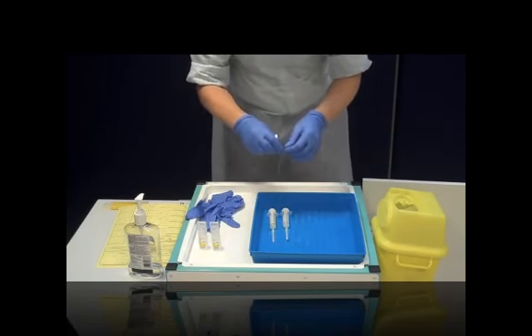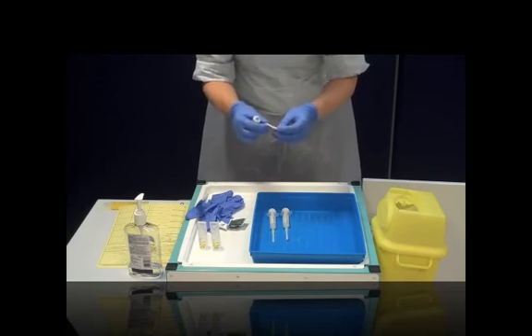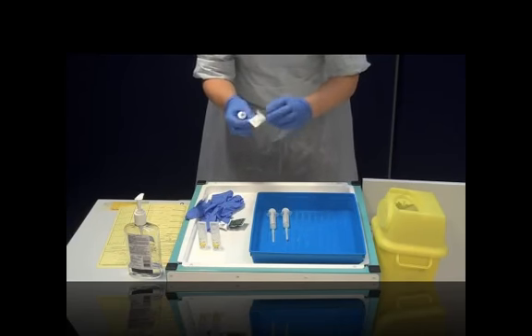Take the top off the antibiotic and give it a clean with one of the ChloroPrep wipes.